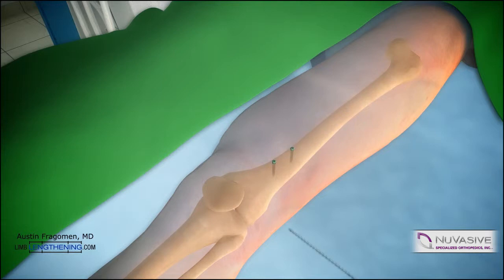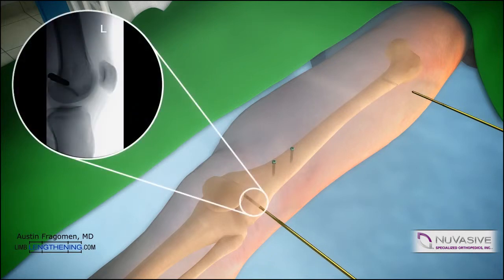Next, the rotational markers, or external fixator, can be applied. Typically, 5 or 6 millimeter half pins are used for this. The distal half pin needs to be drilled posterior to the path of the IM nail. The proximal pin can be in the middle of the canal, provided it's proximal to the nail. The pins are inserted by hand. This magnification shows that the pin is posterior to the path of the nail.